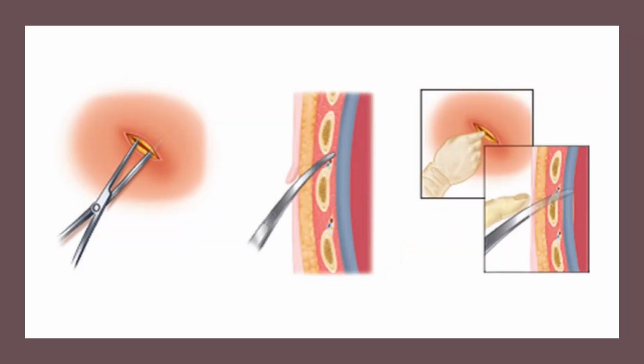5. Bluntly dissect with a hemostat or Kelly clamps through the subcutaneous tissue to the level of the intercostal muscle, with intermittent opening of the dissection instrument during advancement. 6. Digitally palpate the selected intercostal space along the superior margin of the inferior rib. Pay careful attention to avoid the neurovascular bundle lying inferiorly. Move your finger around to confirm you are in the pleural space by feeling the lung.